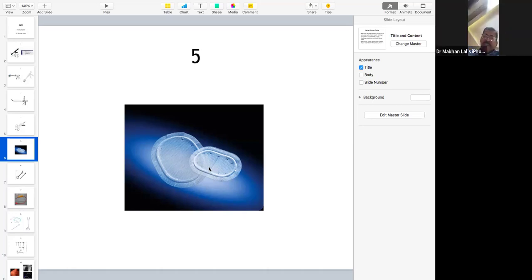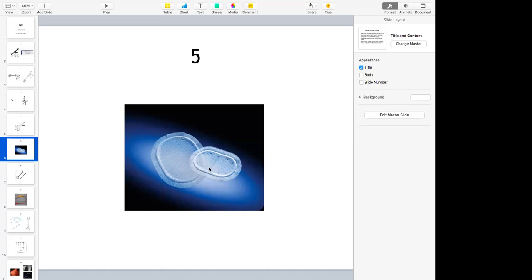And Nyhus repair. The giant prosthetic reinforcement of visceral sac is for both sides, but if you are doing one side, Nyhus repair is also a preperitoneal mesh placement. Stoppa or Wantz repair, or as sir said. So you know all these techniques, and then you can be asked questions about mesh materials. So what are the different materials that are available for meshes nowadays?